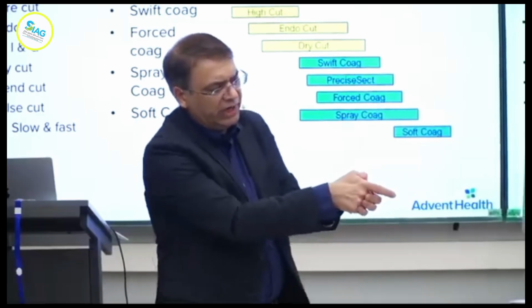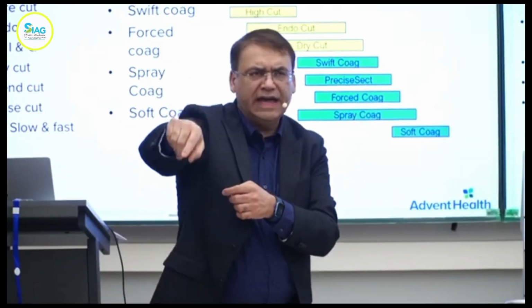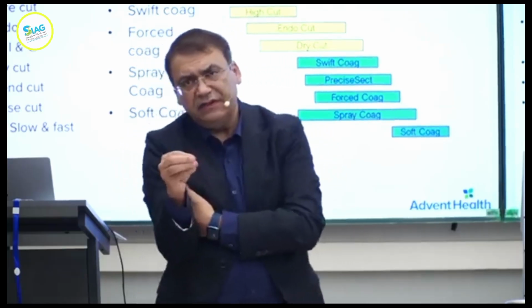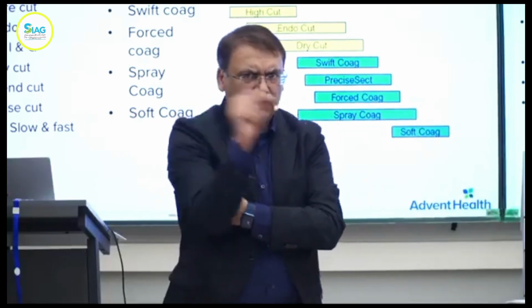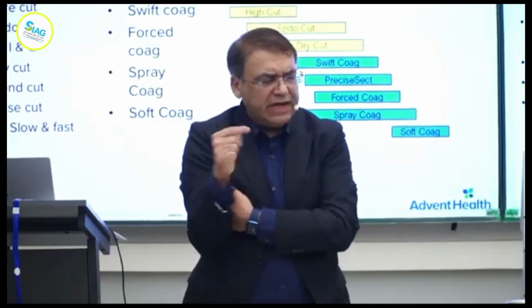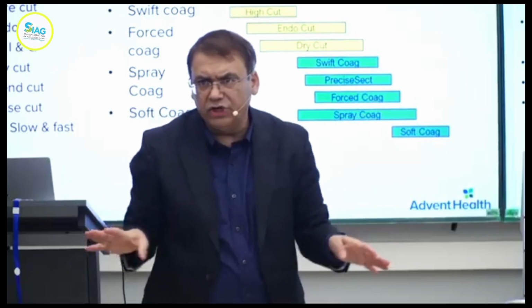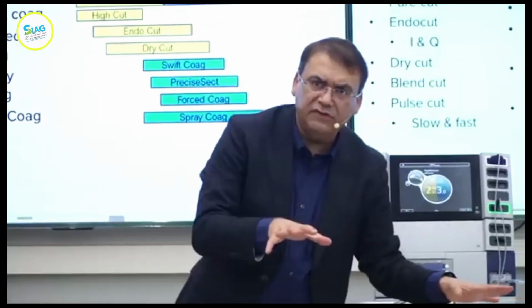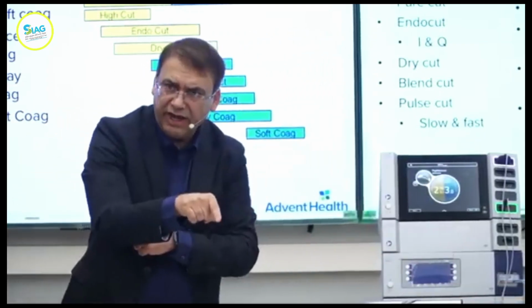I think this is a good way to show the current. Like density, you talked about that. Density is another concept. All the current, as I said, that comes out of the generator goes through the circuit and it has to come back. It has nowhere else to go. So the reason the grounding pad works is that it doesn't burn, but the snare is burning, right?